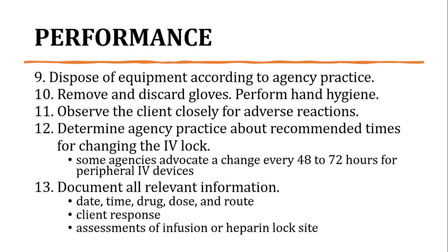Some agencies advocate a change every 48 to 72 hours for peripheral IV devices. Then, document all relevant information such as the date, time, drug, the dose, and the route of administration, the client's response, and the assessments of infusion or heparin lock site.